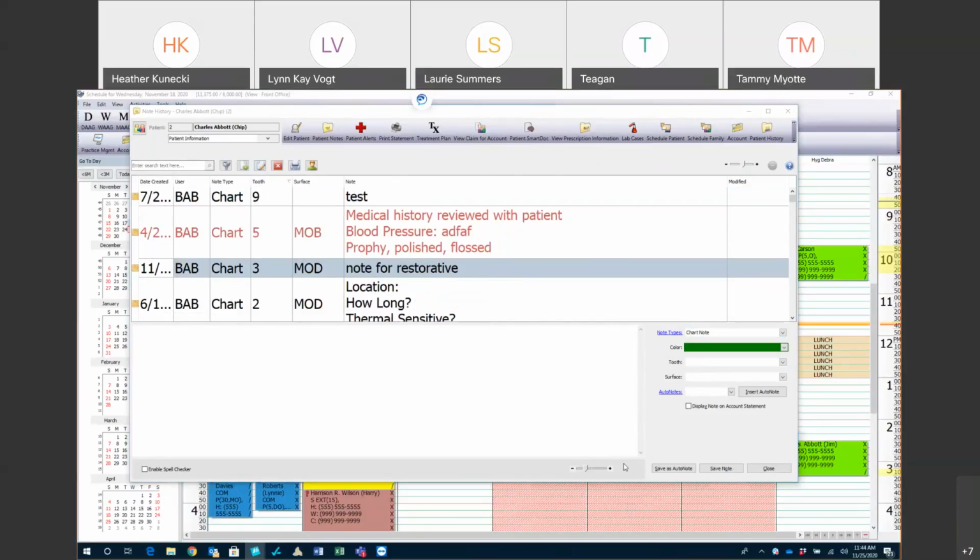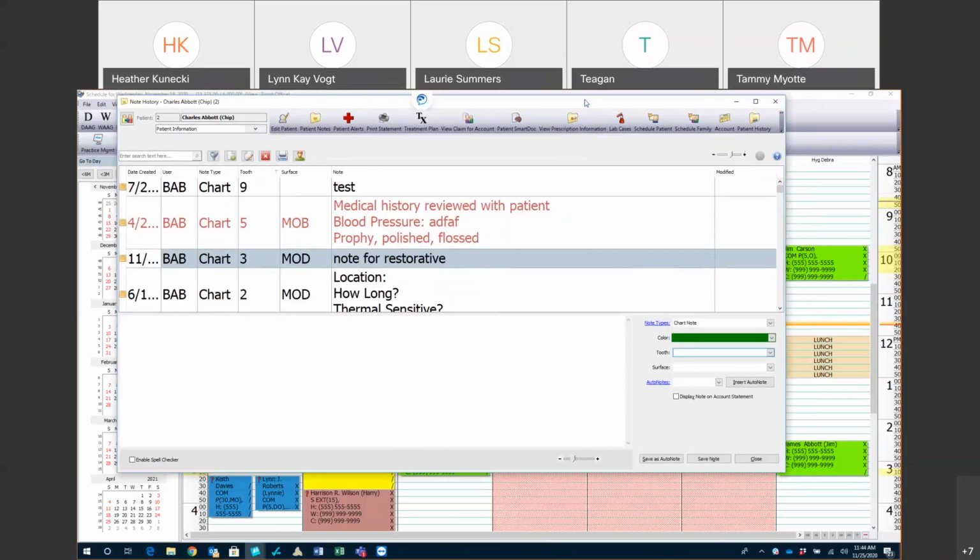Does Eaglesoft integrate with Dexys? Yes. Dexys is integratable. So Tom will just put in the Dexys drivers into Eaglesoft. Yes, there is one I think that does not work that well with it. I think it's Carestream, but that's not the Dexys one. But those cameras do. Yep, Dexys is supported by Eaglesoft. So you can have those cameras.